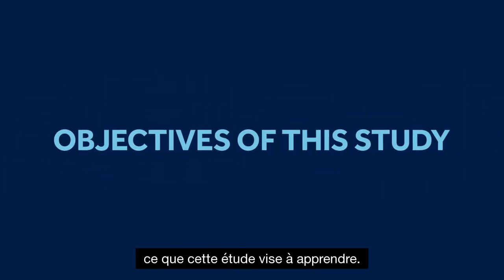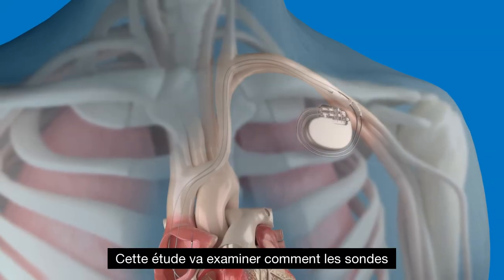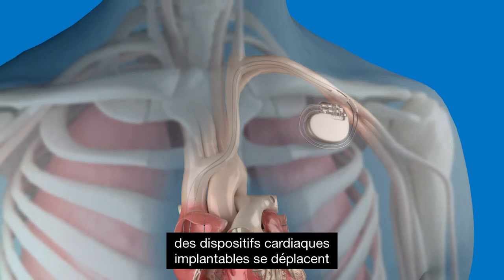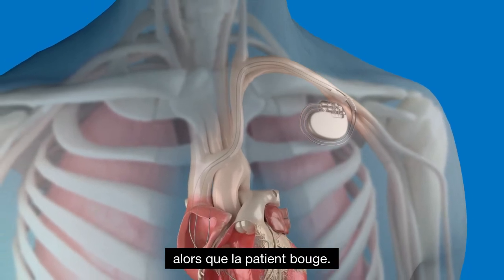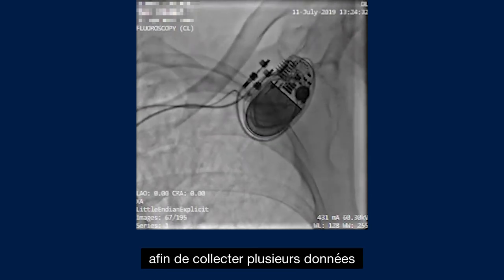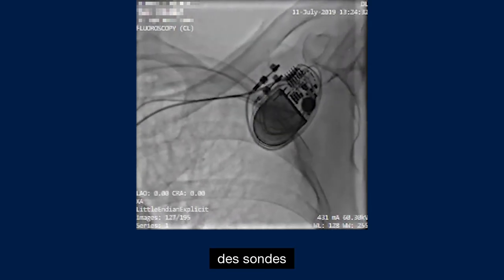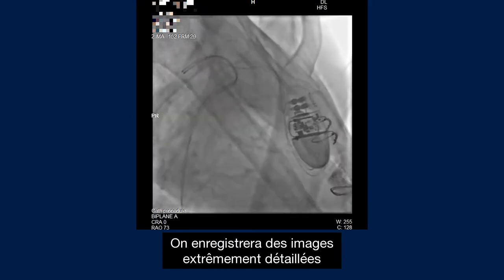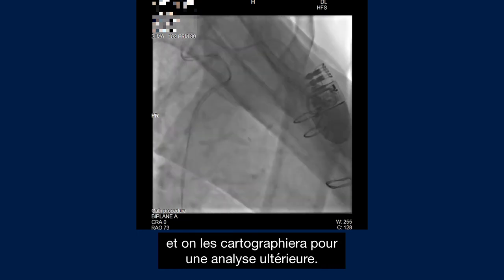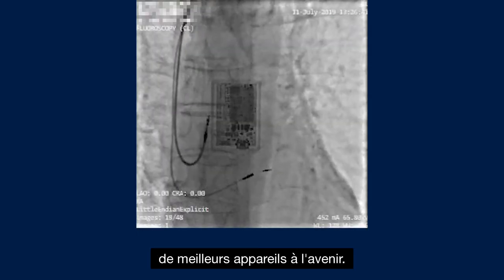Let's start by reviewing what this clinical study is aiming to learn. This study will examine how the leads of implantable cardiac devices move inside the body as the patient moves. We are working with several leading institutions to gather a large body of data specifically looking at the movement behavior of the lead inside a patient's body. We will be recording extremely detailed imagery and then mapping it for later analysis. This information will help us design better devices in the future.